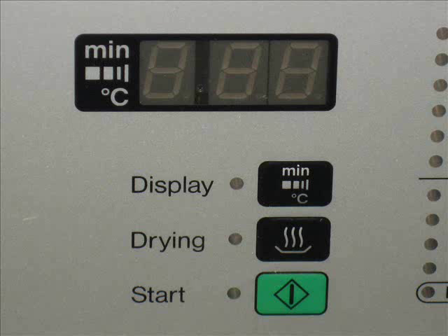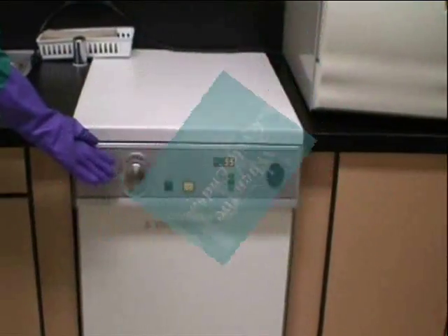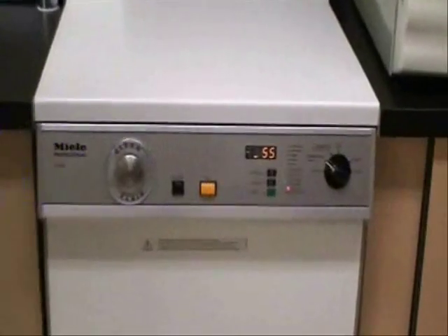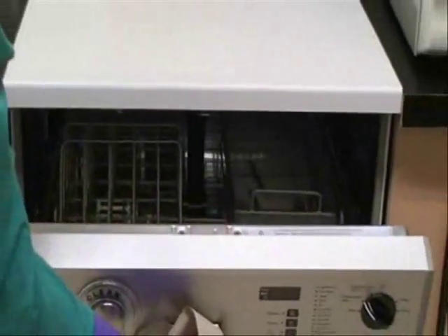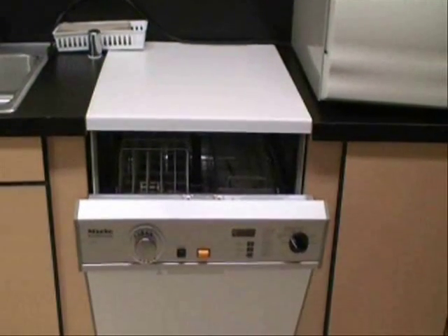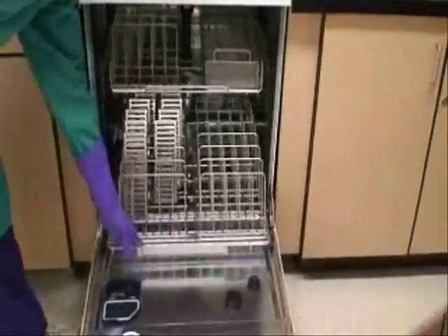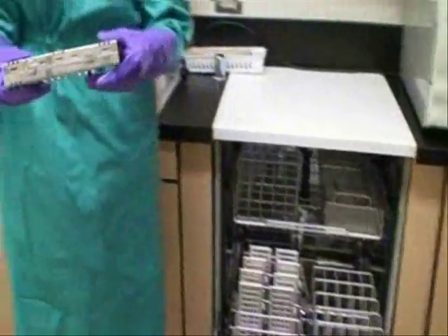Make sure that the Millay is set for the Disinfection Vario program. Then press the start button. When the cycle ends, open the door with a paper towel to release hot air and steam. Let the instruments and cassettes cool down. At this time the instruments are ready for wrapping and sterilization.